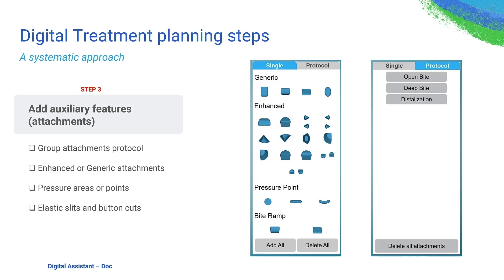The next step is to add auxiliaries — basically attachments, elastic slits and buttons, pressure points. For attachments, we have two approaches: you have the protocol attachments for open bite, deep bite, and distalization. You could also create your own attachments, which is a huge advantage — you can use single attachments that we have, both generic and enhanced. In the new version coming very soon, we actually improved the automatic placement of these attachments. Sky's the limit when it comes to your lab — you can create your own system, use the built-in system, modify it, and save it as your own protocols.